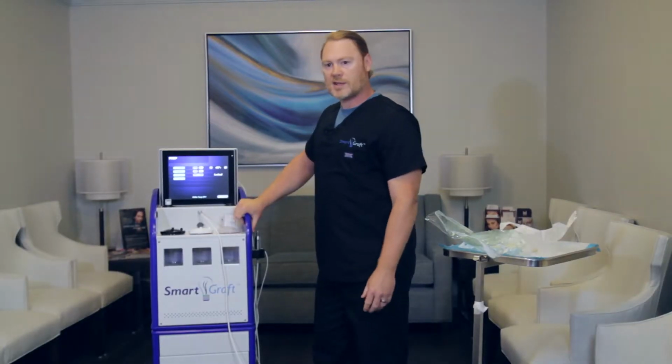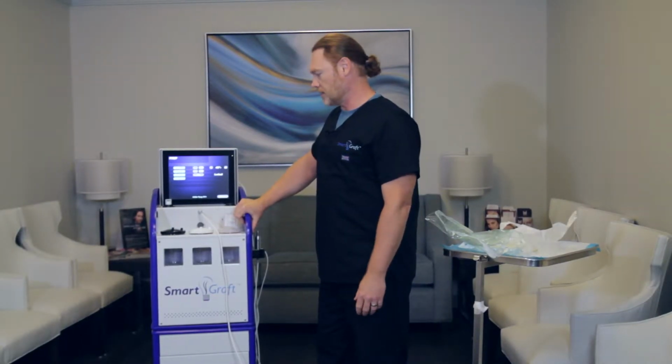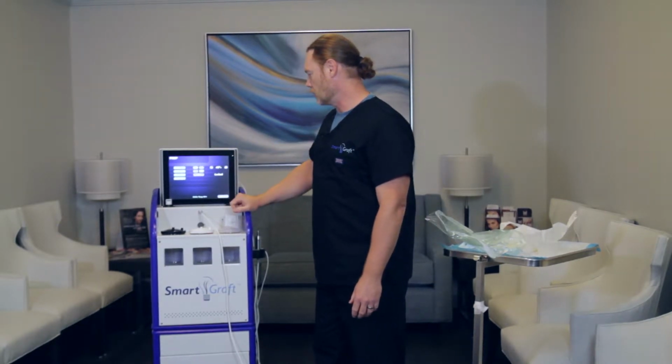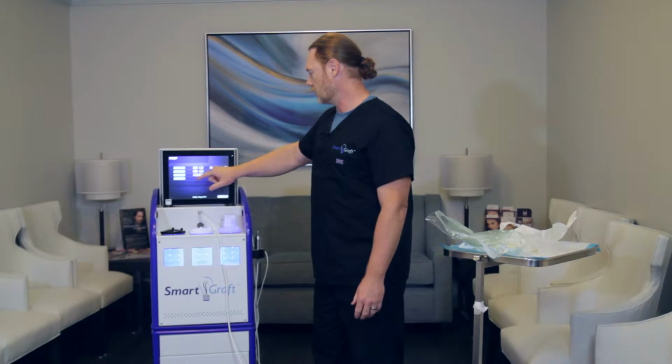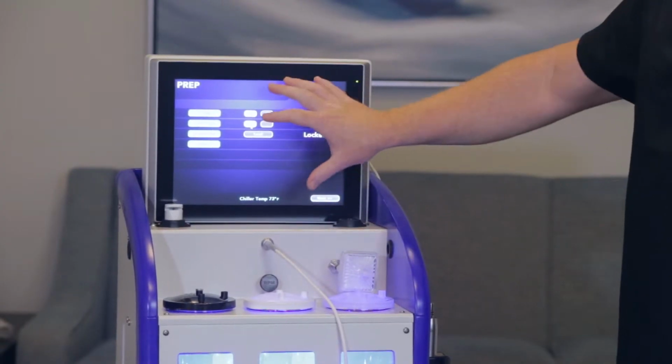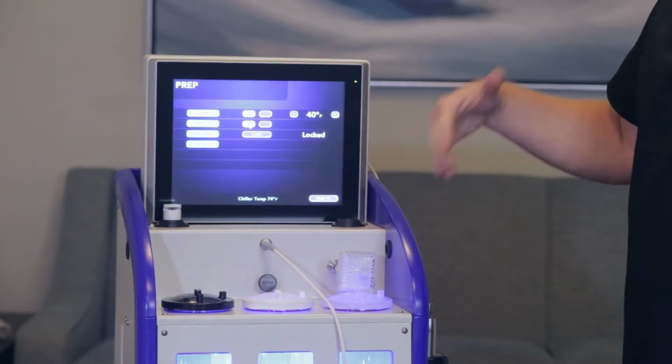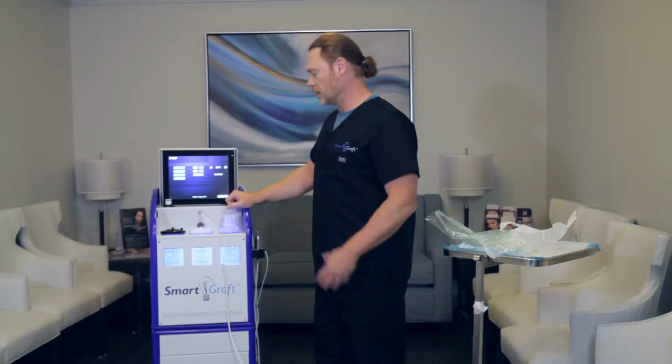Now, first thing you should do when starting your device is to actually use the chiller and get that down to a good temperature, so you want to put that on and the chiller light itself. This is the first touch screen of 2. Here is a next button, and we'll get into that a little bit later here, but let's first connect the tubing.